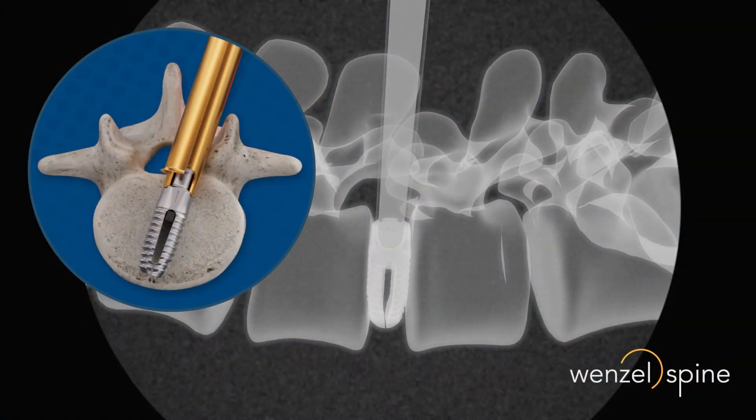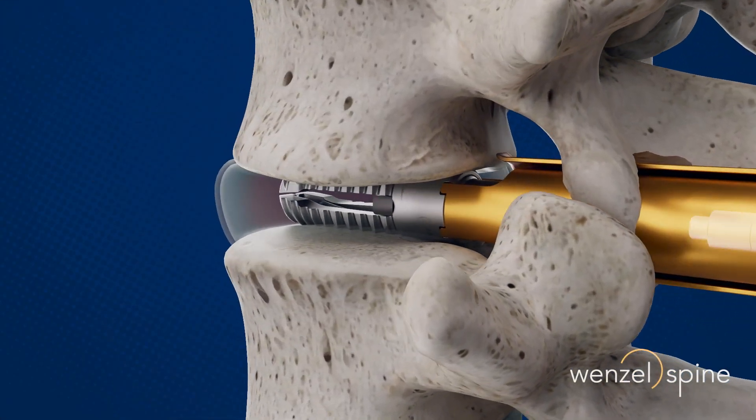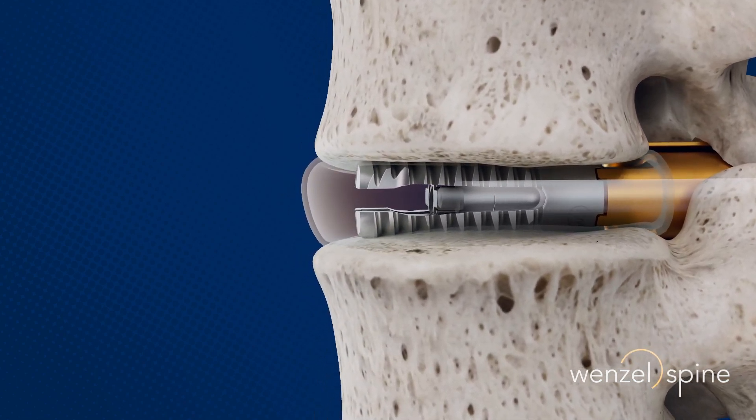Fluoroscopic guidance is used to confirm implant placement and trajectory. The device must then be fully expanded by advancing the expansion plate distally and locking it into place.